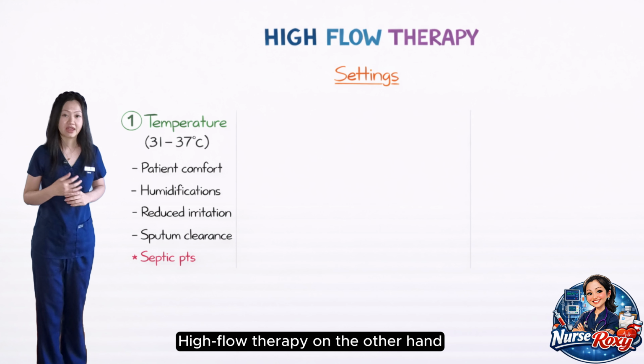Before we dive into the theory, let's quickly look at what a high flow therapy is made up of. A high flow device consists of a heated, humidified circuit that is connected to a bag of sterile water, an oxygen tube that is connected to a flow meter, and a breathing circuit that can be used either with a mask or a nasal cannula.